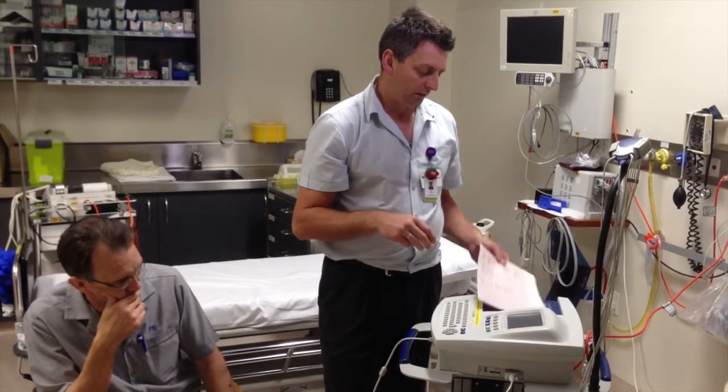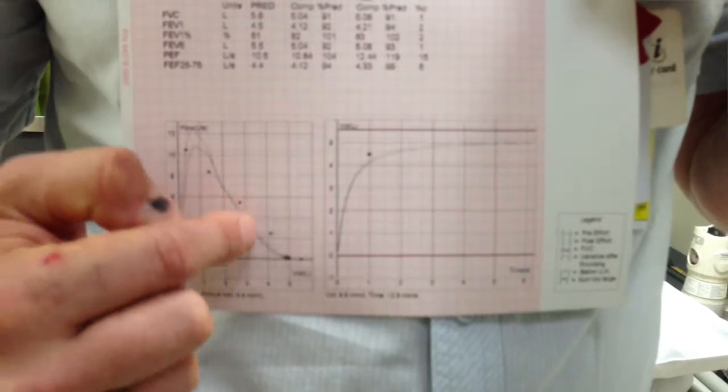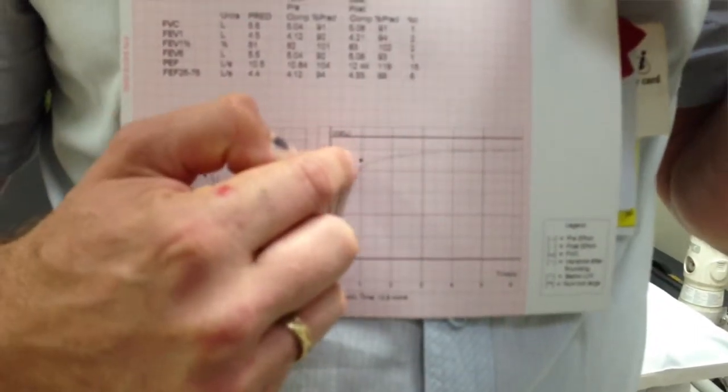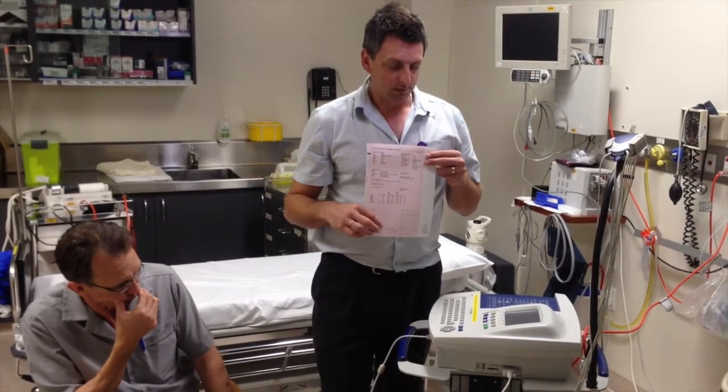It gives a beautiful graph and prints it out. You tear this off and give it to the doctor to review. It will have pre and post tests on it with a graph down the bottom showing the pre and post, and the dots are the predicted markers of where they should be for their weight, size, and age. That's about it for how to do a spirometry — hope that helps. Ask if you've got any questions and we'll see you on the next QtNOW video. Take care.